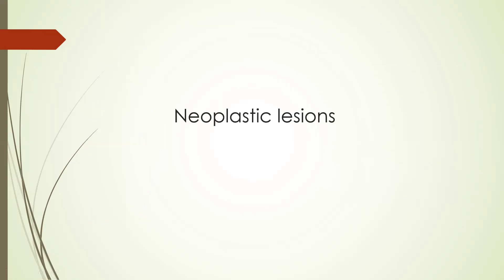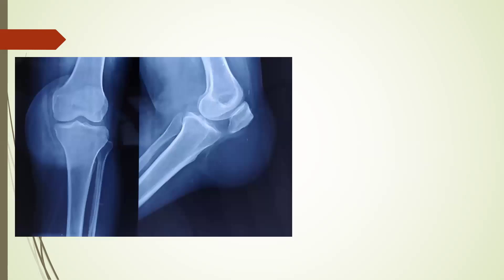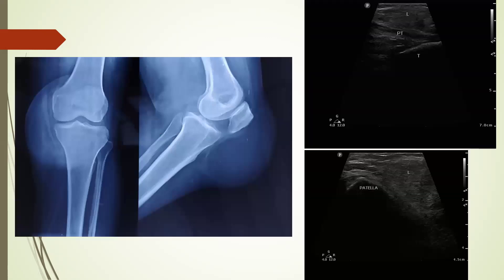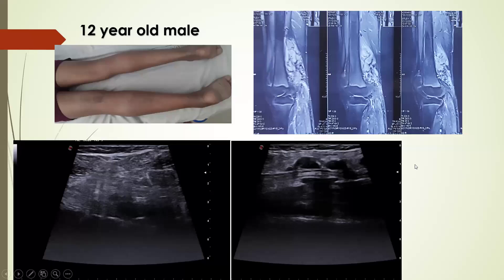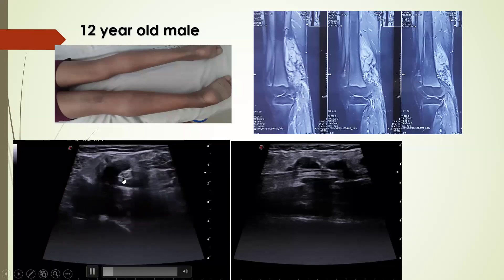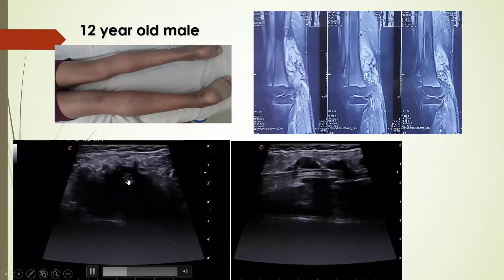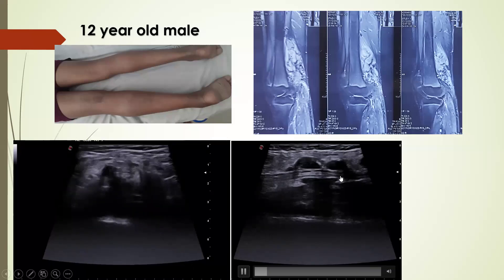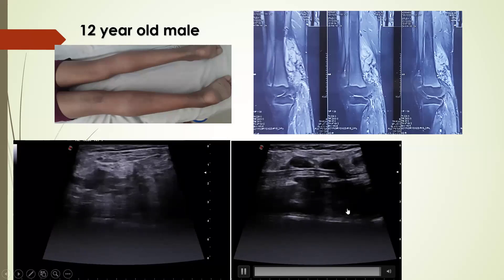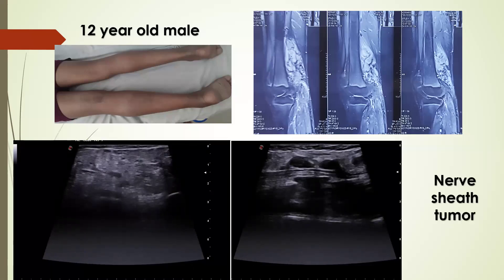Neoplastic lesions can also occur around the knee joint. In this case there is a large hyperechoic lipoma in the prepatellar region. In this 12-year-old male there is a large lesion in the posterior part of the distal femur extending to the popliteal region, encasing the sciatic and tibial nerves. On ultrasound-guided biopsy it turned out to be a nerve sheath tumor.